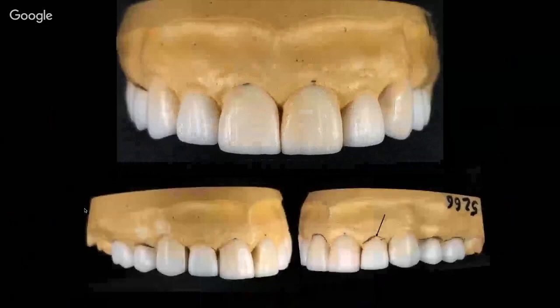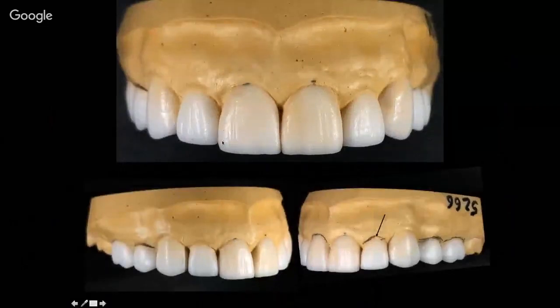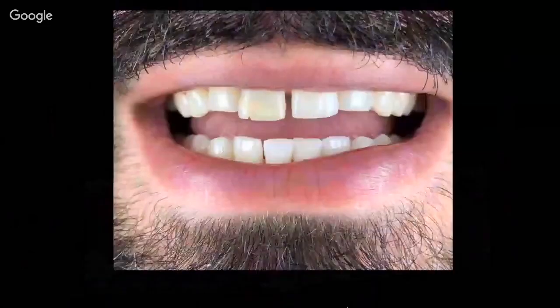You can see even the surface texture on the wax-up, the angulation, the morphology, and the proportion between the teeth. And on this wax-up, we can decide where to work on the gum level in case of a gummy smile or disharmony in the soft tissue. So this was the conventional way.